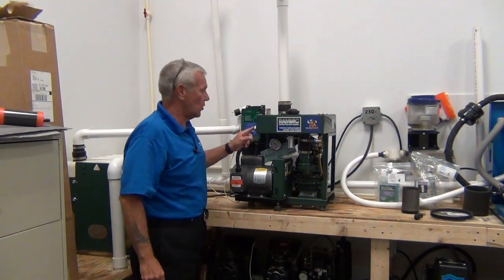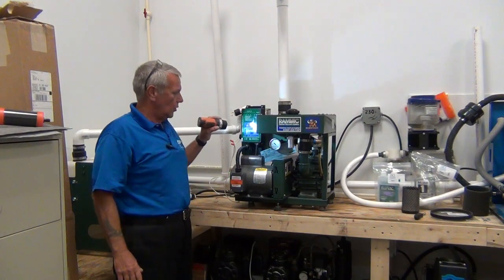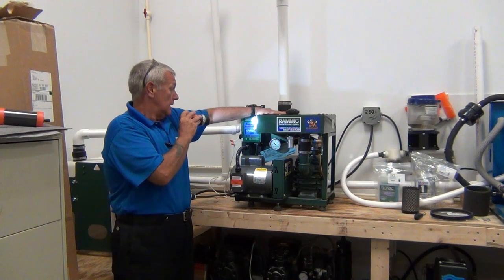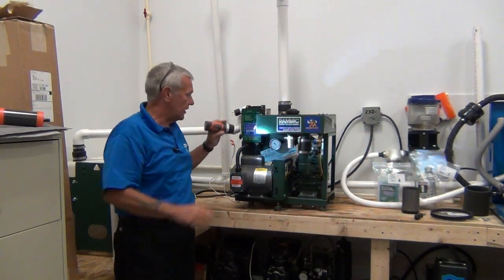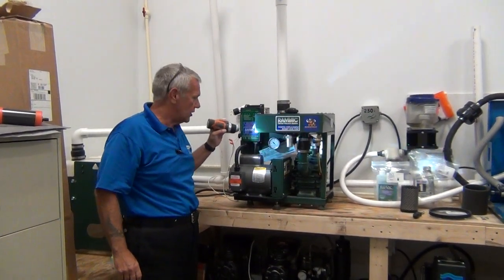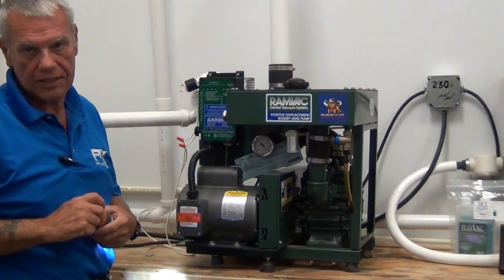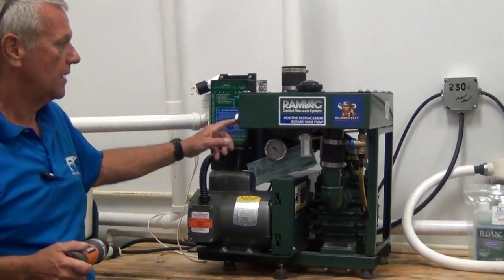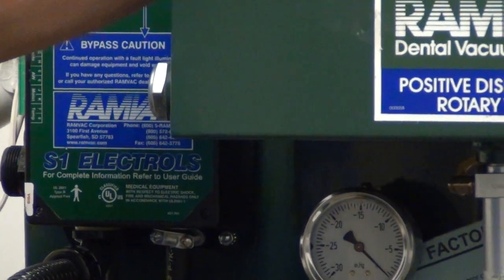The first item we're going to check is the oil level. The oil level is readable on top of the oil reservoir. It takes three quarts of oil. There's a sight glass, very similar to an air compressor, that you can check the oil level with. The oil should be halfway up the sight glass, right here. This is where you add oil in case you do need to add oil.